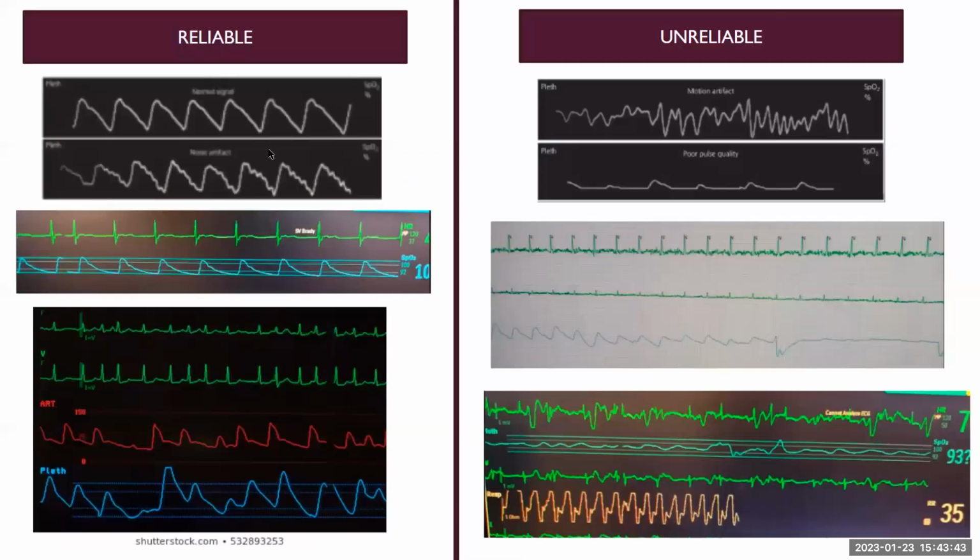So looking at these graphs about what is more reliable, it's important to remember that the pulse ox is measuring the amount of oxygen per pulse, as a way to think about it. So the level should correlate with the pulses of the heart rate. This correlates with the pulse of the heart rate, and this correlates with the pulse of the heart rate.